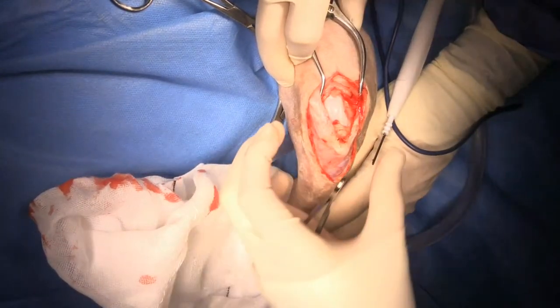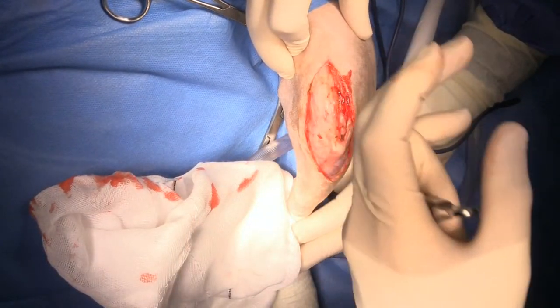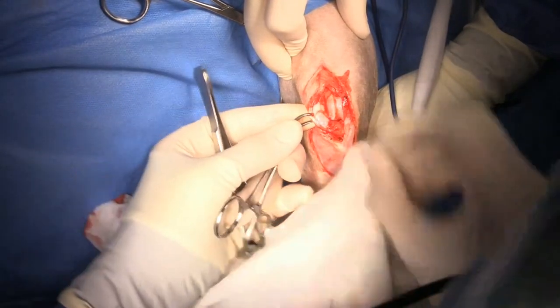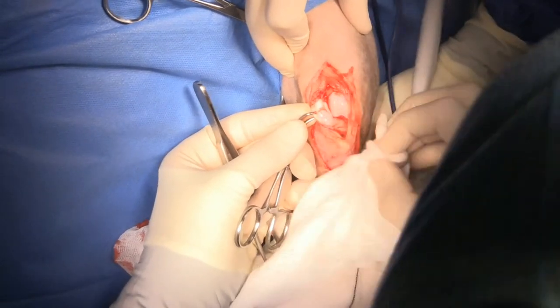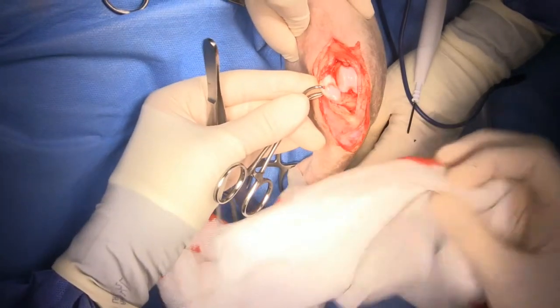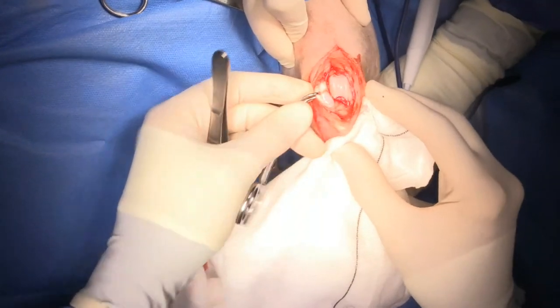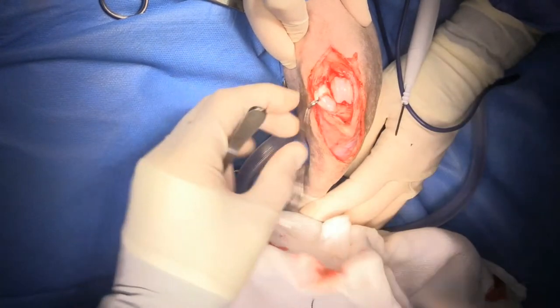Next I'm going to use a towel clamp to look at the articular surface of the patella and make sure that there's no fibrillation or full thickness cartilage wear. I'm also trying to get some assessment of whether this groove is deep enough. You want about 50% of the thickness of the patella to be within the groove, and in my opinion that groove is pretty deep, so I'm not concerned about that at all.